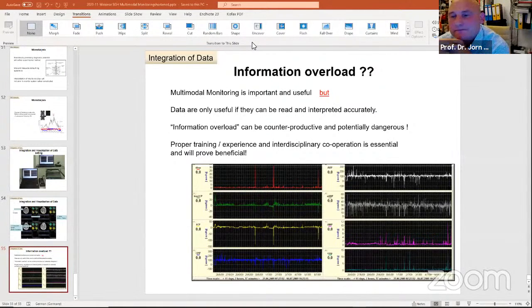The exception is post-operative monitoring. Sometimes after a brain tumor, after a hematoma, after whatever, they put in an ICP monitor, and these ones you can assess clinically. But as soon as the patient is awake, you usually don't need the ICP monitor, because of the risk of infection and so on. And they wouldn't like that anyway. If a patient is awake and you try to put in a probe, that's not a good idea. If the patient wakes up and you can do proper clinical examinations, you can usually take out the probes.